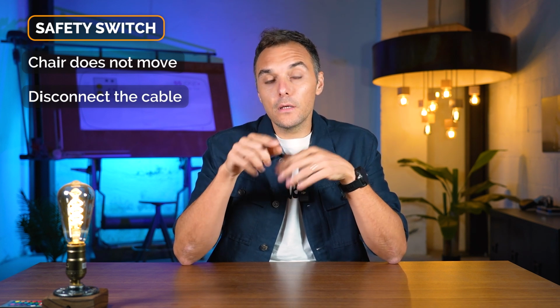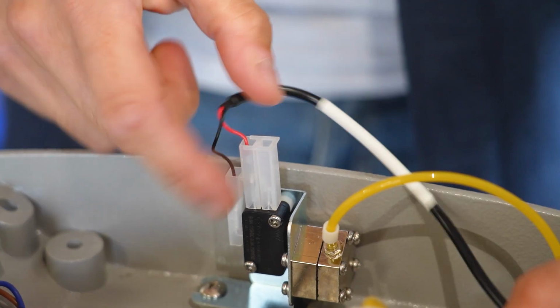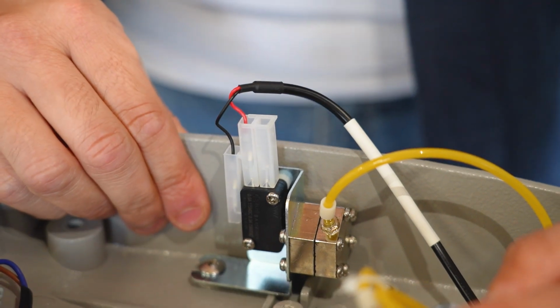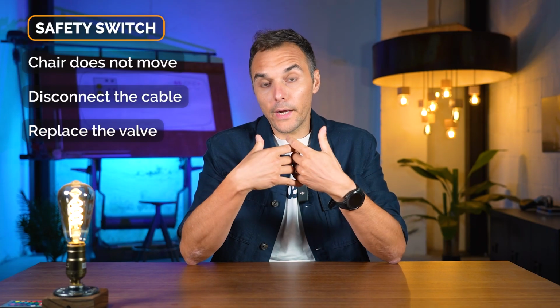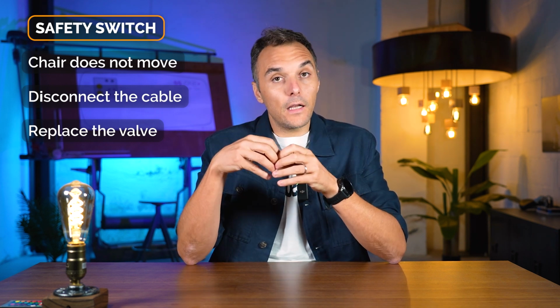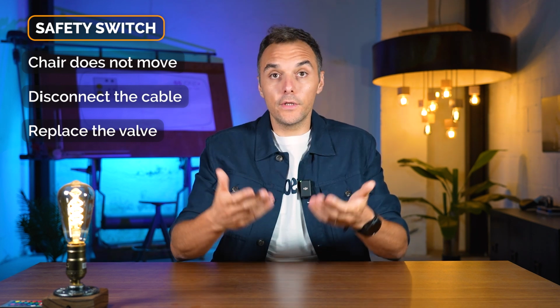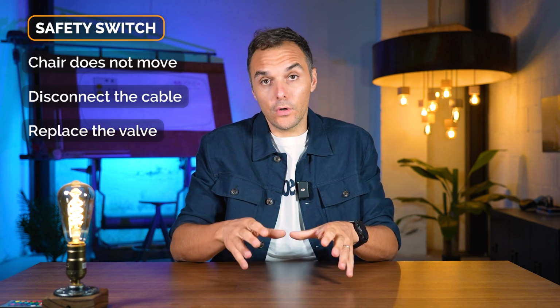In this case it can be this cable, and of course at the end of the cable there is also a valve that is the one that activates or deactivates this function on the unit. This function is normally, when the chair performs correctly, it means that you cannot move the chair while the doctor is operating. But in case the valve has some problems, by disconnecting the cable you can avoid this function of the unit. Of course it has to be temporary until you solve the problem.